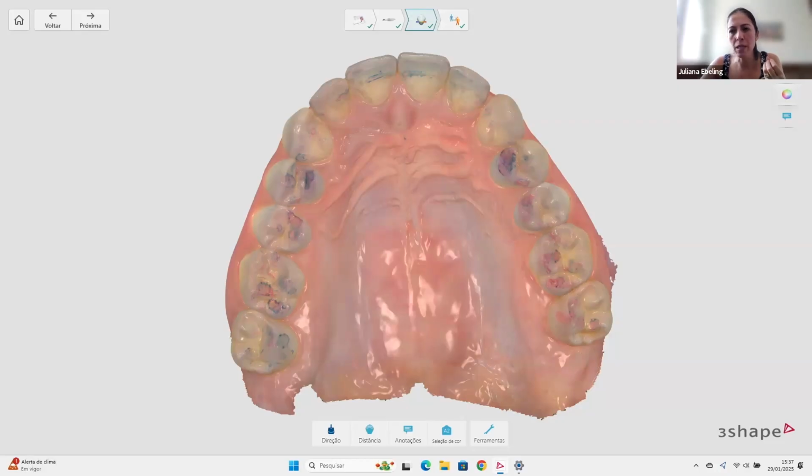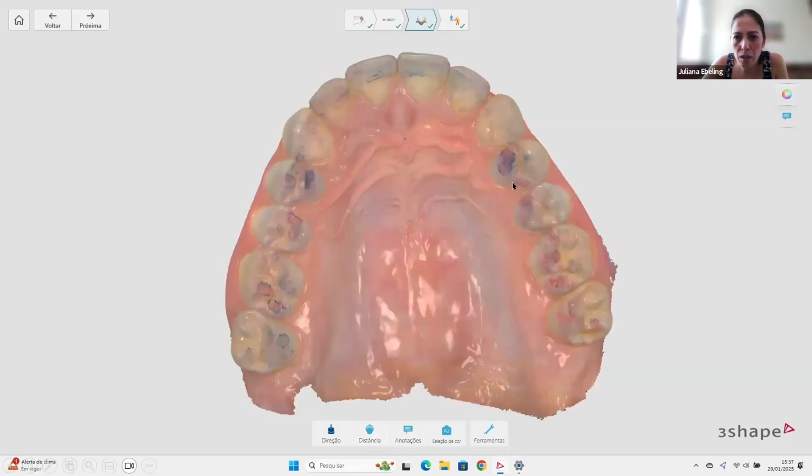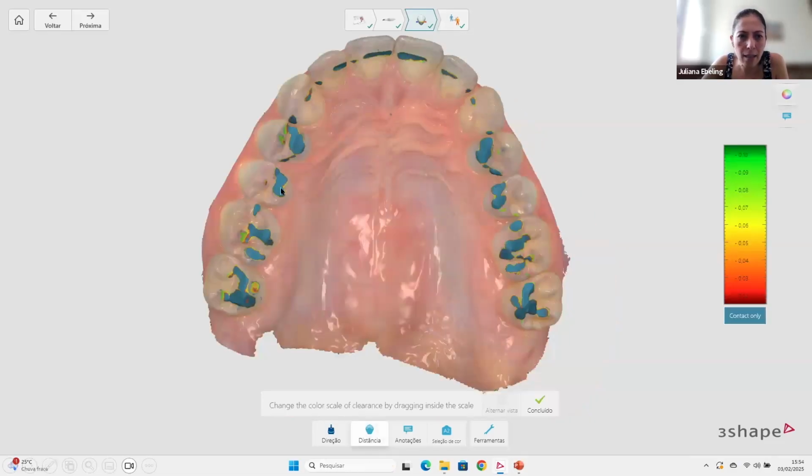This surface is very important for the function and how intense the muscle activity should be for the system to work. And here, what do I find with the scanner? The same. It's exactly the same picture. Here it's an occlusogram from TRIOS, and here I can adjust the scale.